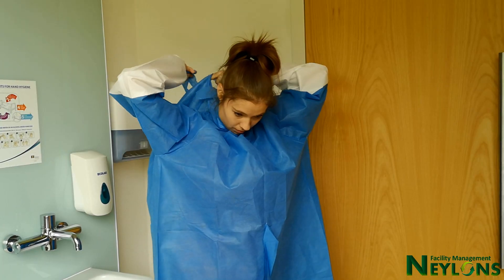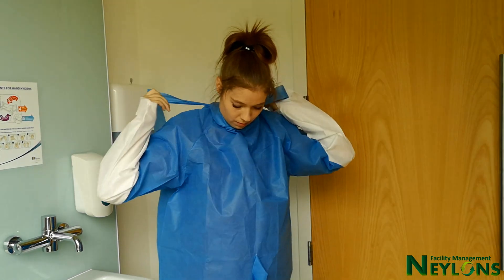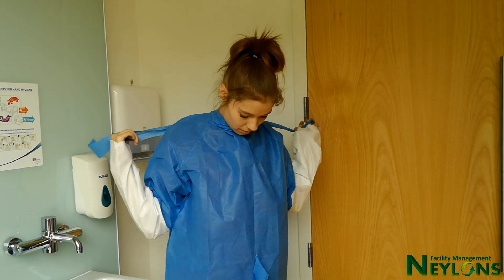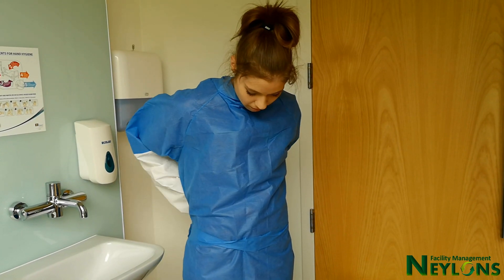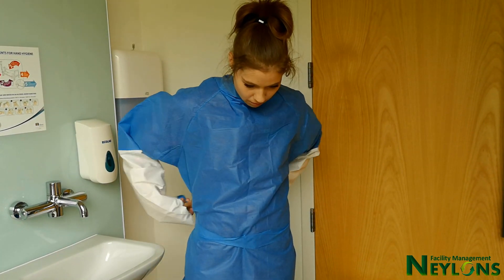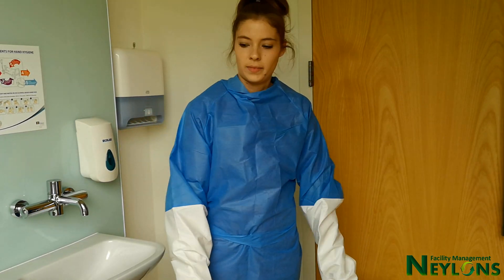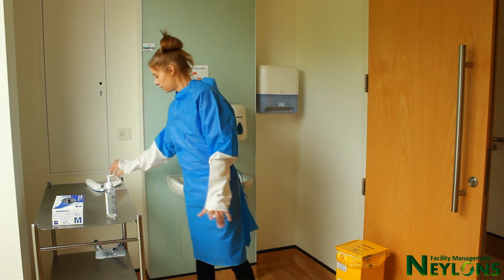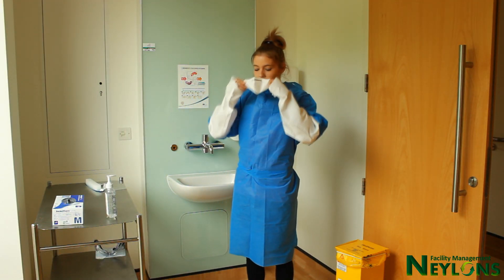You will select the type of PPE you need based on the task you are carrying out and the type of transmission precaution the patient has. Put on your mask, press and seal the mask around your nose and under your chin.